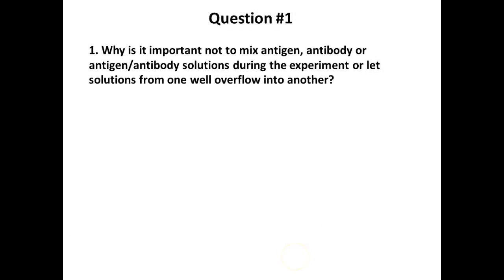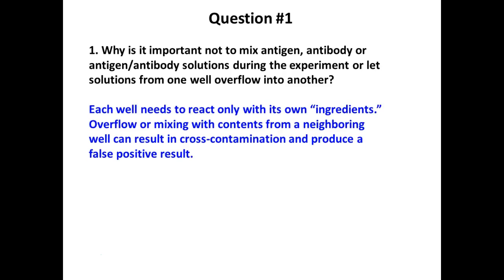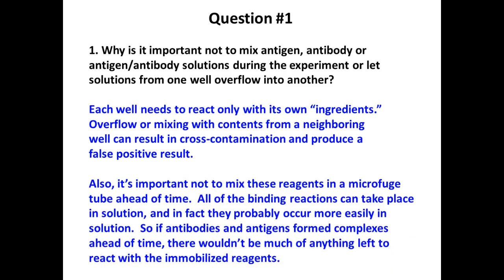So, why is it important not to mix antigen and antibody solutions during the experiment? You're going to mess it all up, right? There's a reason why these are separated from each other. And this is also why it's important that we don't overflow our wells, so we don't get mixing between the wells. We don't get that cross-contamination, most likely ending up with false positive results rather than negatives.